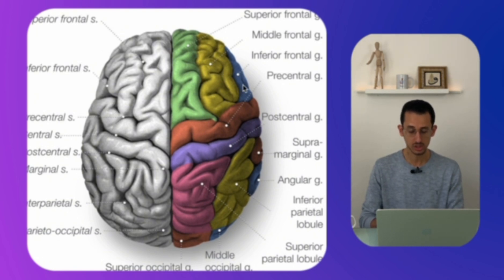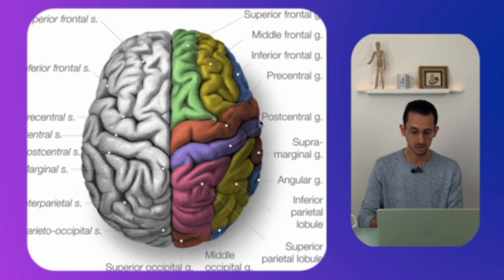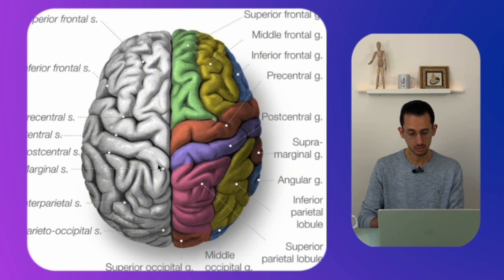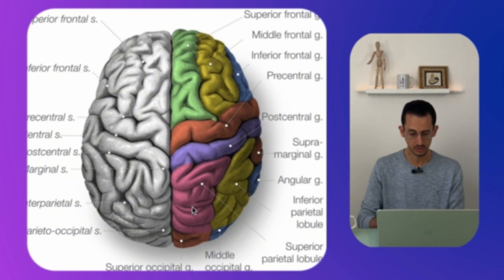We have the pre-central sulcus that separates all three frontal gyri from the pre-central gyrus. After the pre-central gyrus, you have the central sulcus, and after that comes the post-central gyrus, which is part of the parietal lobe. You can also see the marginal sulcus — we'll talk about this later as one of the ways to identify the motor cortex — as well as the superior and inferior parietal lobules.